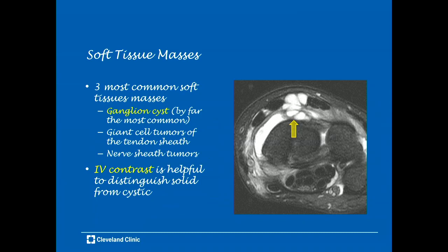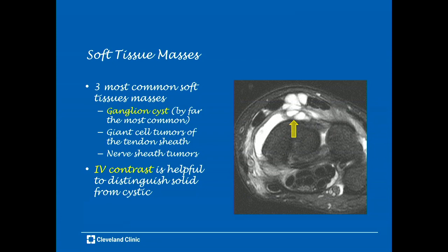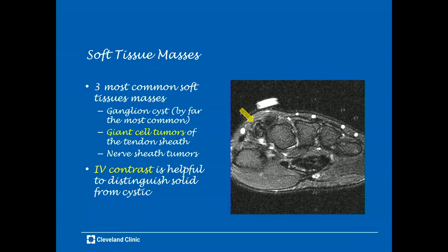Another common indication for wrist MRI is to identify and characterize soft tissue masses. The most common soft tissue masses in the wrist are ganglion cysts, and giant cell tumors and nerve sheath tumors. Ganglion cysts are by far the most common, with characteristic locations such as the dorsal wrist near the scapholunate interval, and are cyst-like with high signal. Giant cell tumors, on the other hand, tend to be low signal on all pulse sequences. IV contrast can be helpful to distinguish a solid from a cystic mass.